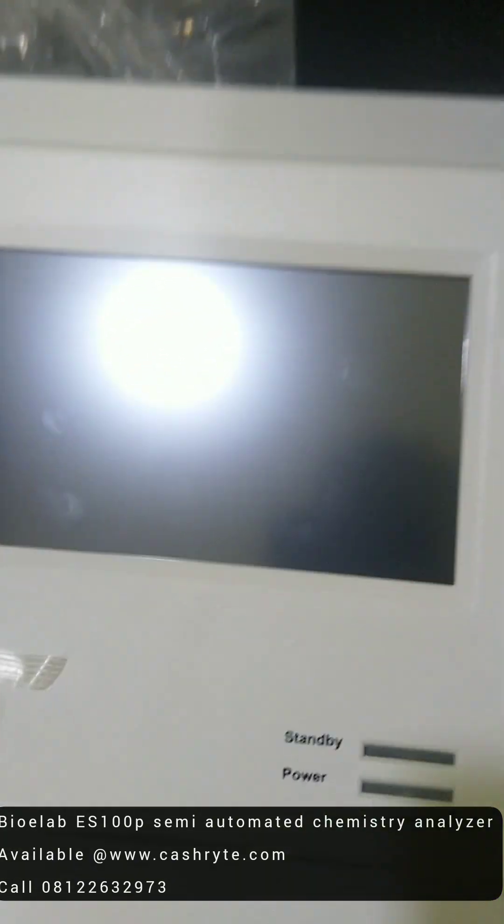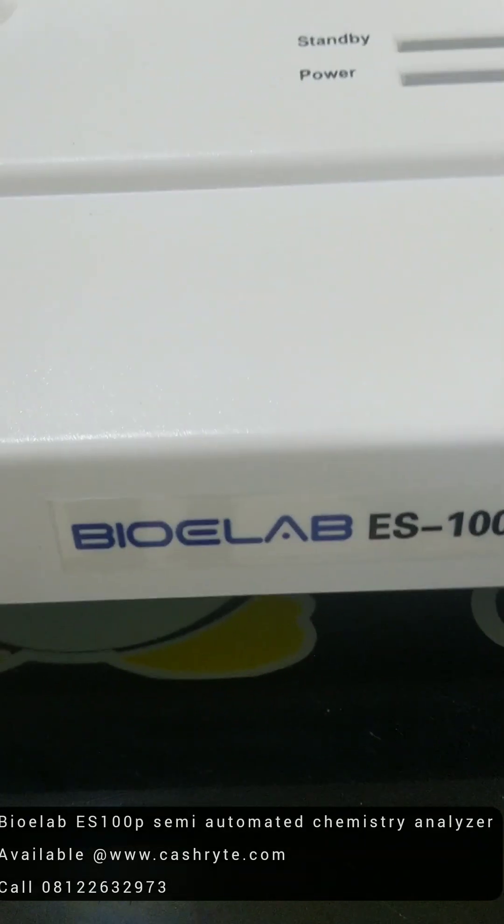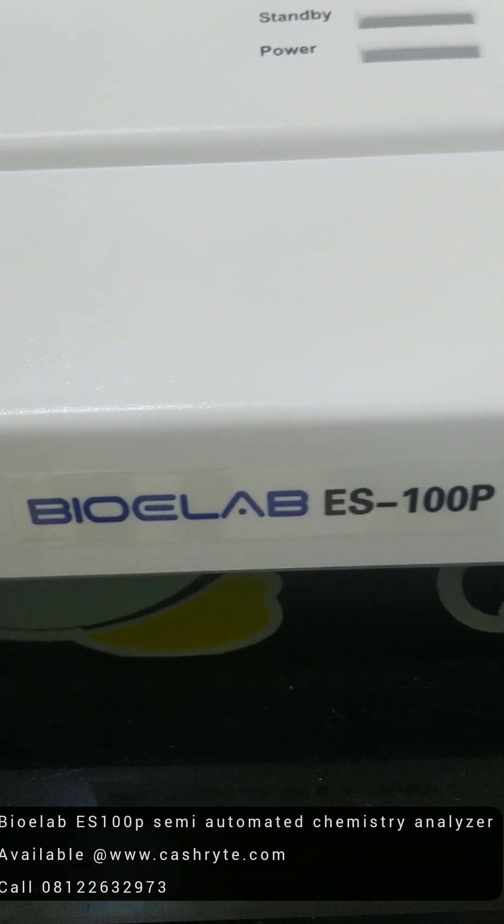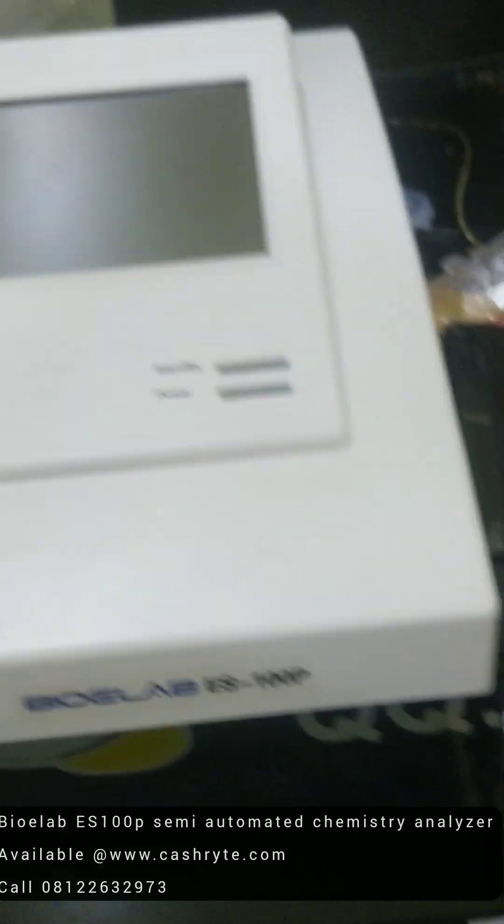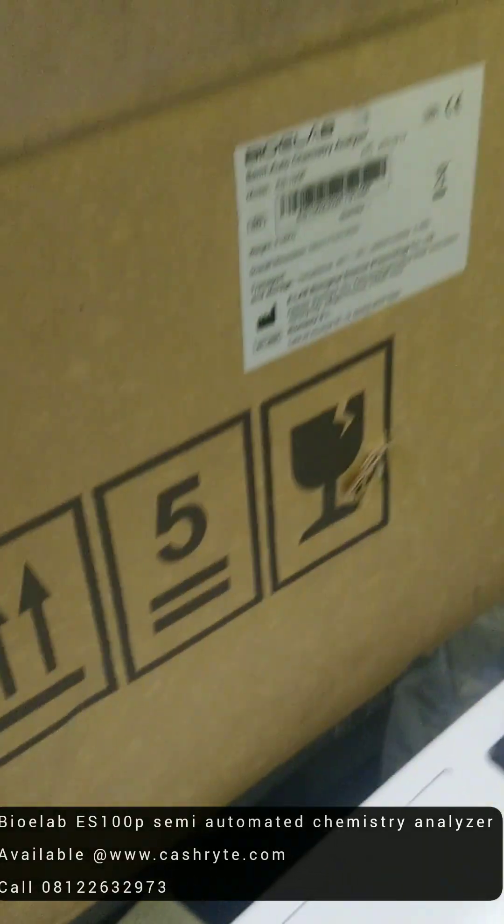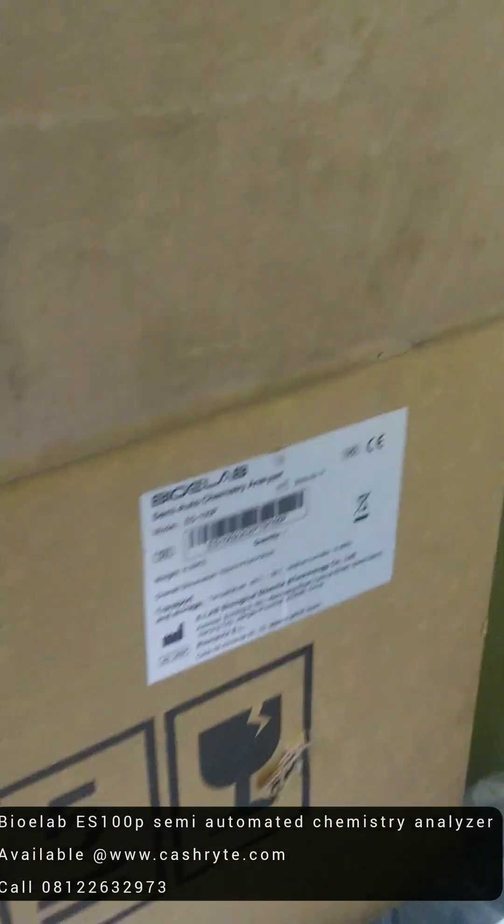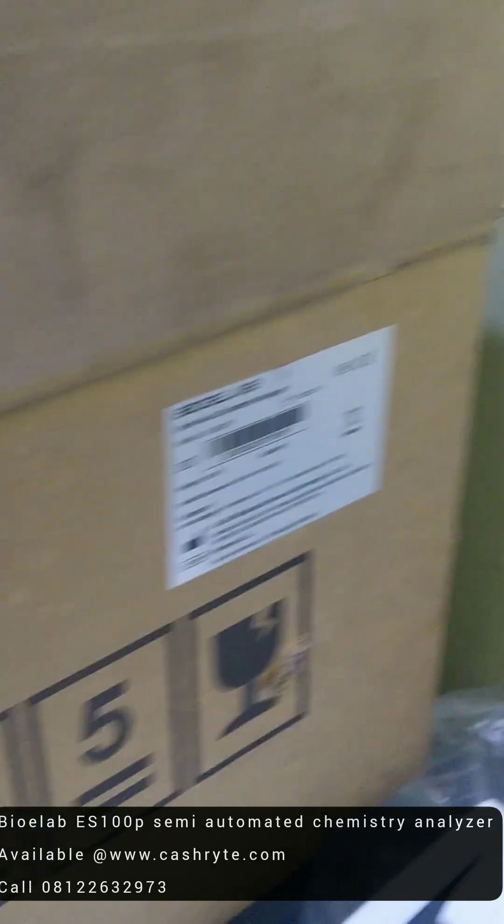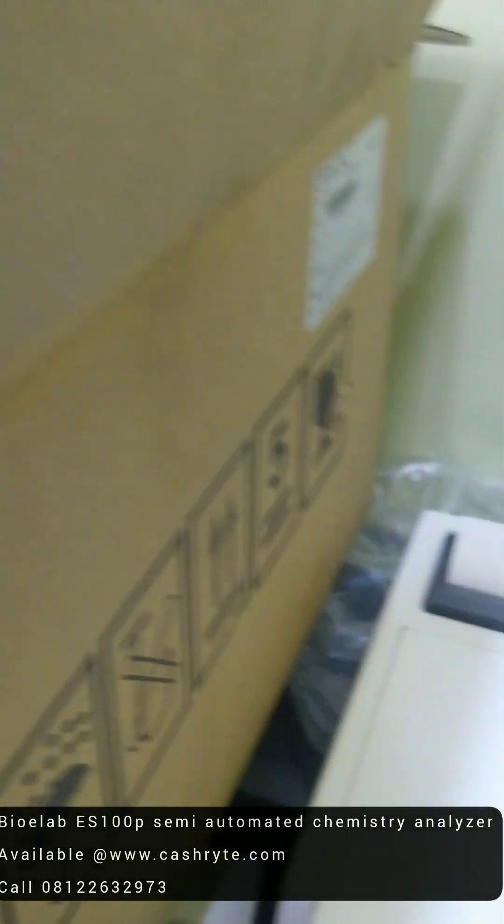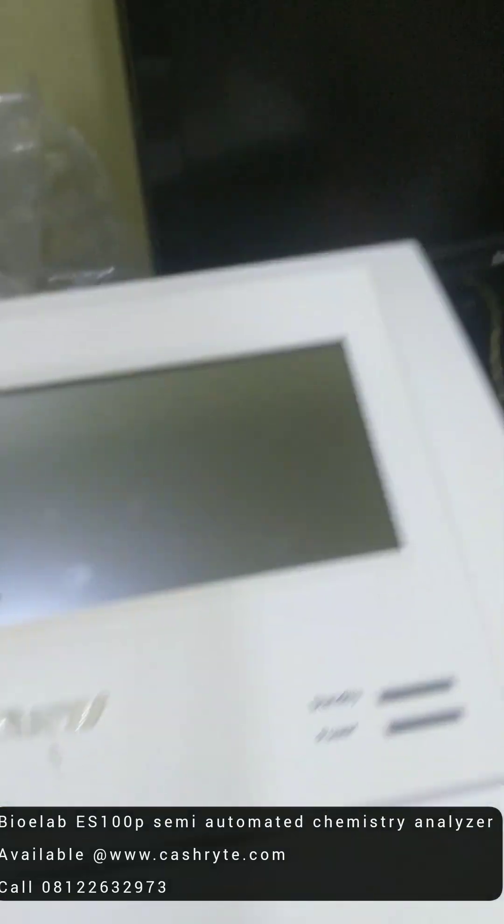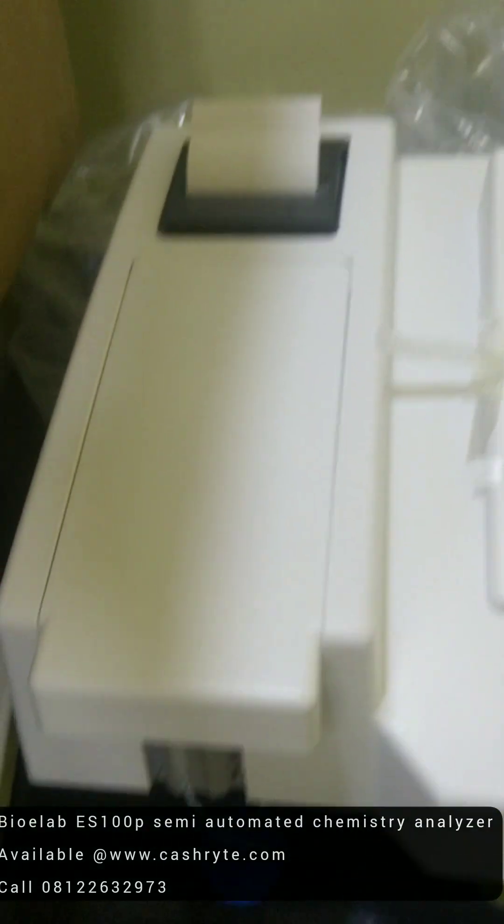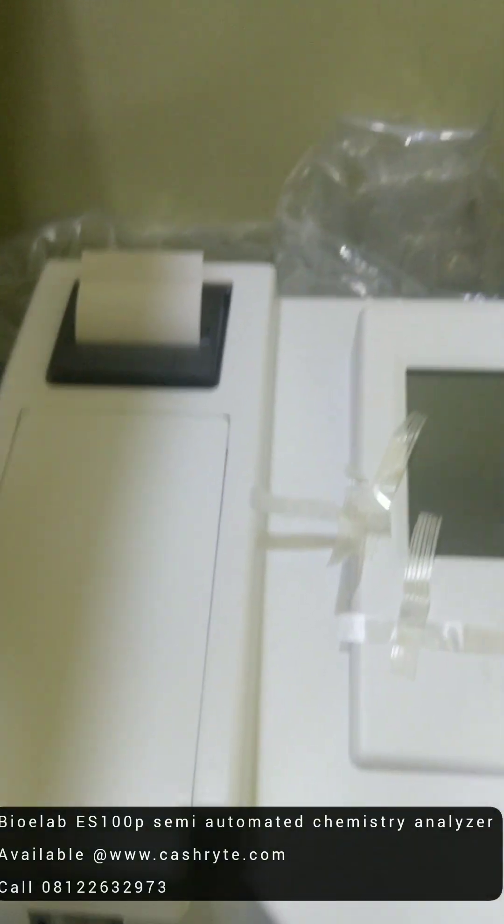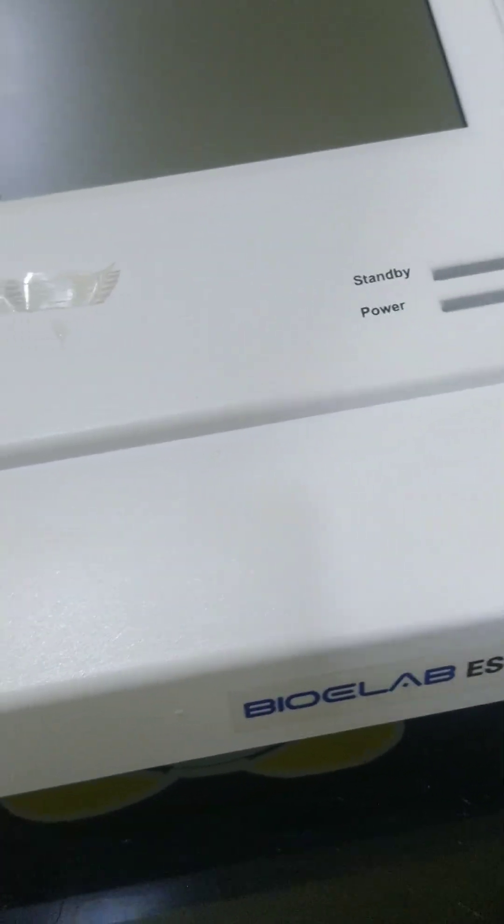So this is BioE-Lab, BioE-Lab ES100P. It's very affordable and it's up for sale. You can get it on our website www.cashbyte.com. This is for a client and we are sending it all the way to Benin. So look forward to receiving your orders. Thank you. Have a blessed day.